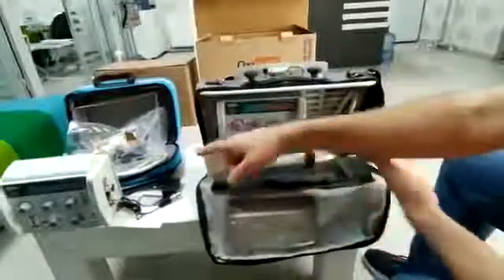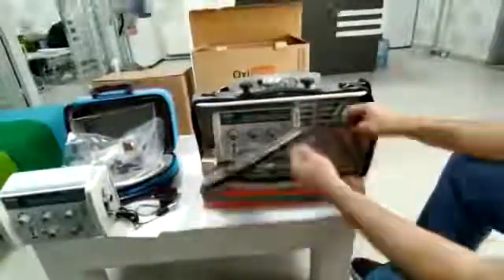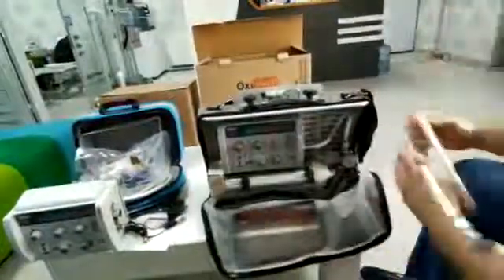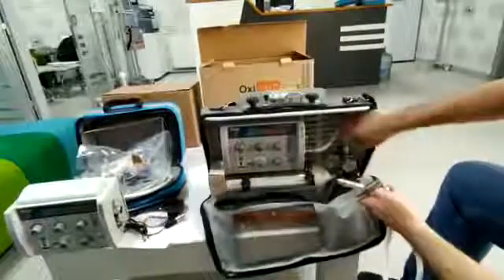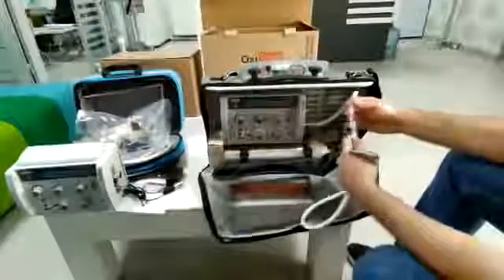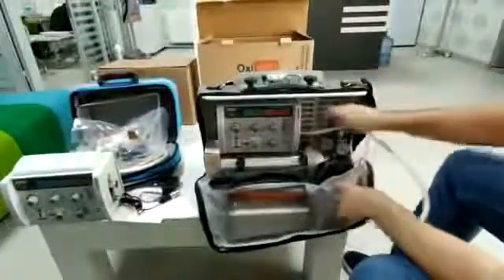You can't use this model with the tube, but you can use this model with the tube. And if you want to use the ventilator with the hospital oxygen system, you have to unplug this line and plug it in, and then you can use the oxygen system.